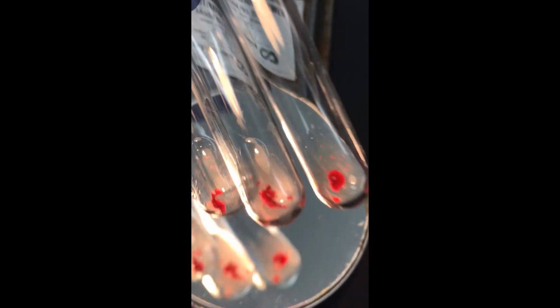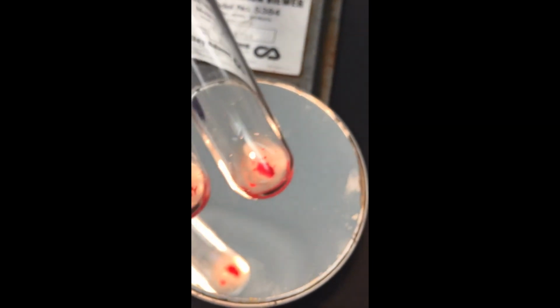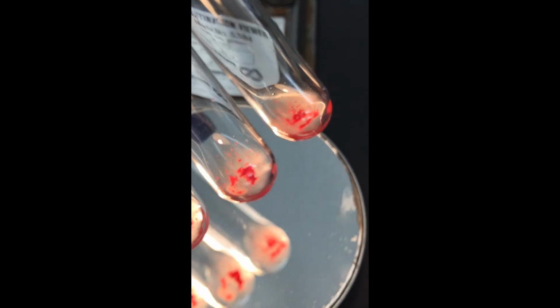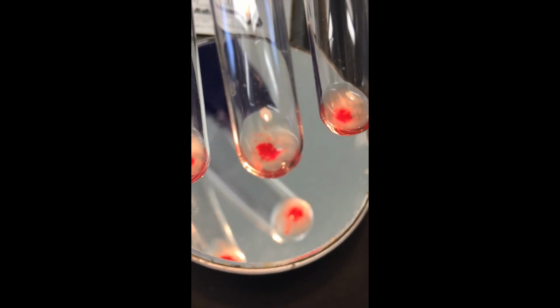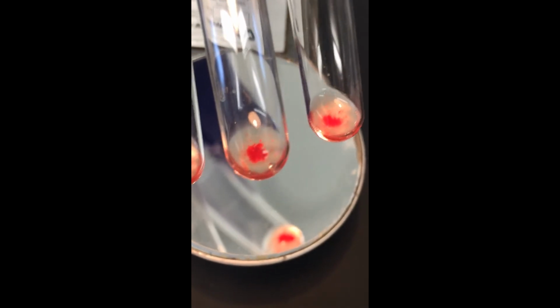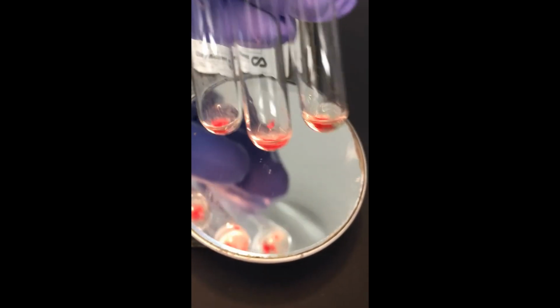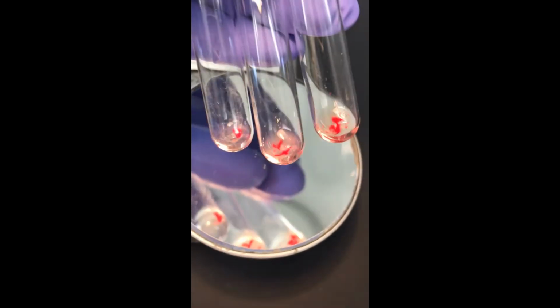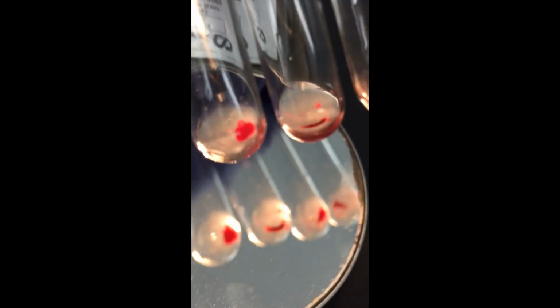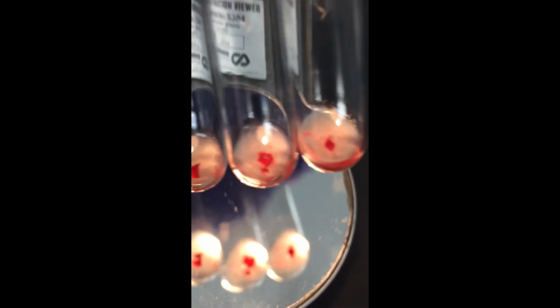This is sample C. Check cells in tubes 2, 3, and 4. Check cells in 5, 6, and 7. Check cells in tubes 8, 9, and 10. Check cells 11, 12, and 14. Love check cells. Okay, check cells 16, 18, 19, 20. Yay!